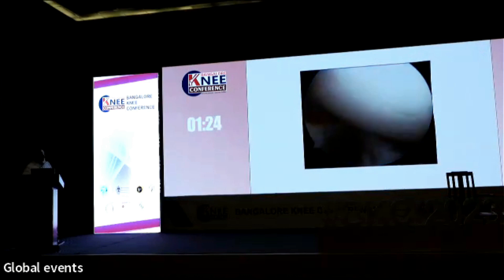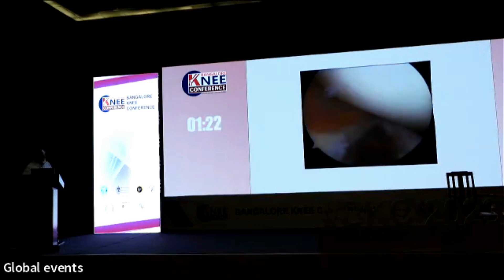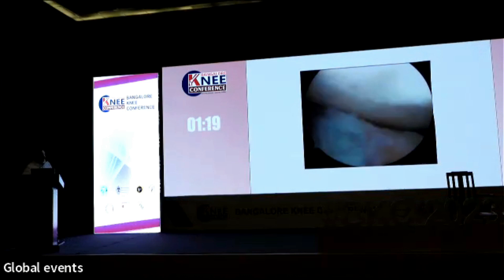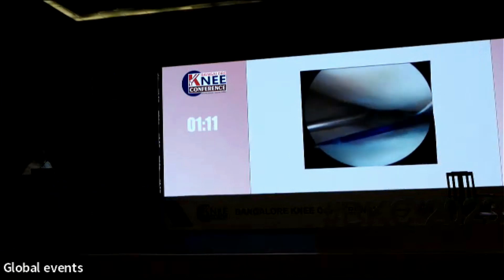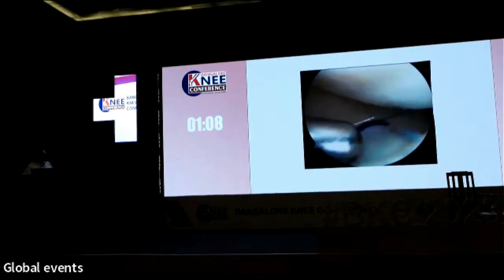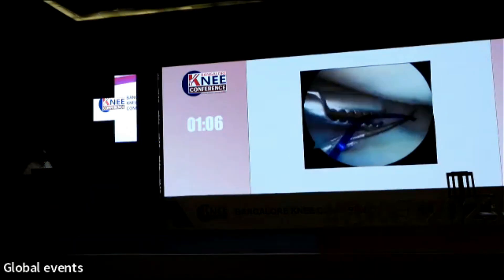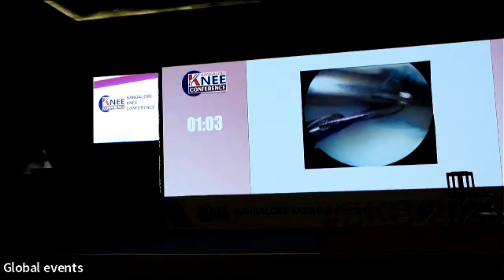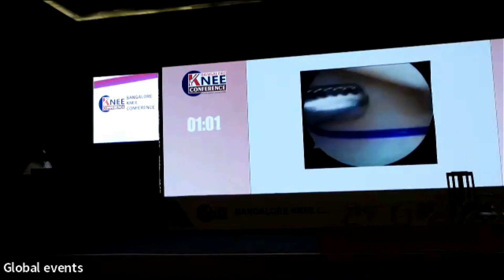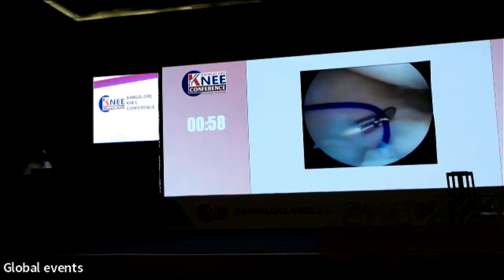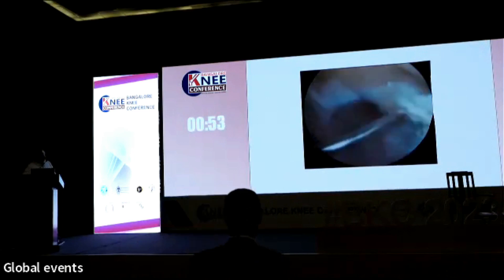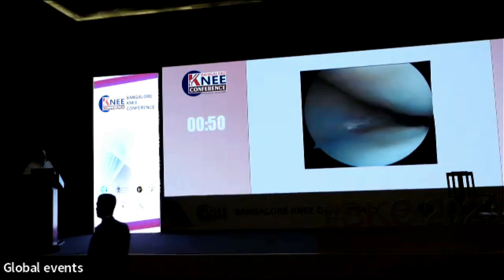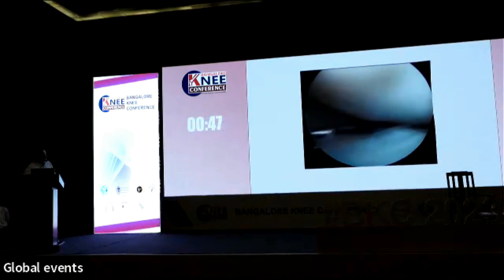The cannula is passed along with the PDS, and the mender device — which has a three-pronged loop — is the second instrument introduced. You can see the steel mender device coming in. It's placed onto the tissue and grasped back, then pulled across into the capsule. You can take two, three, or four bites based on requirement.